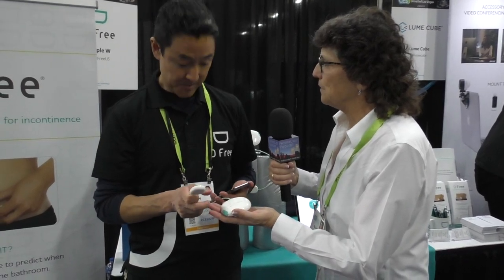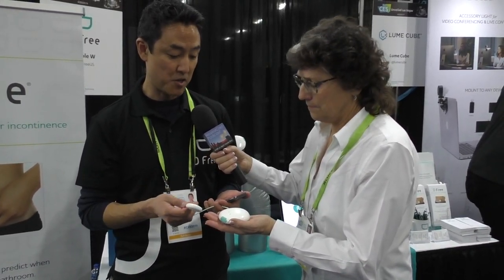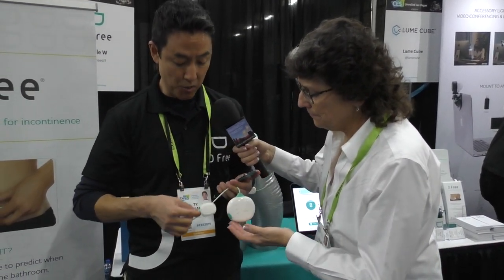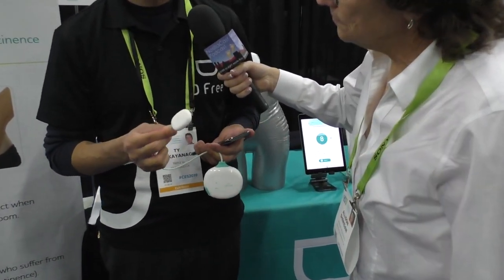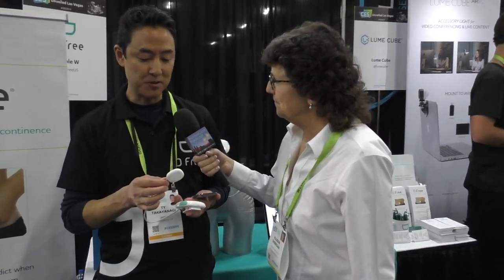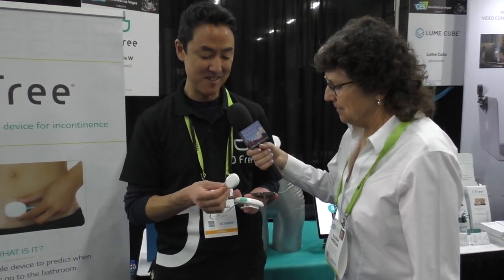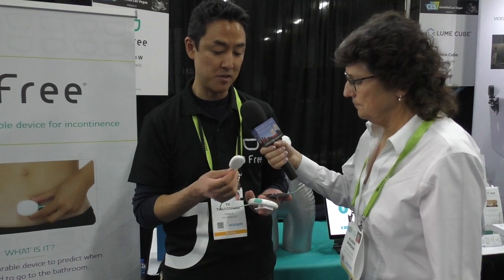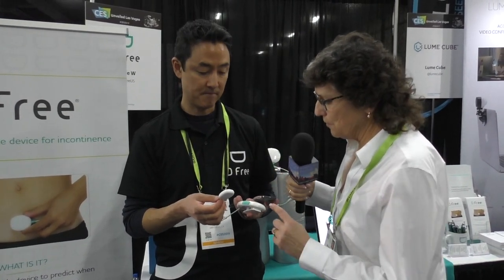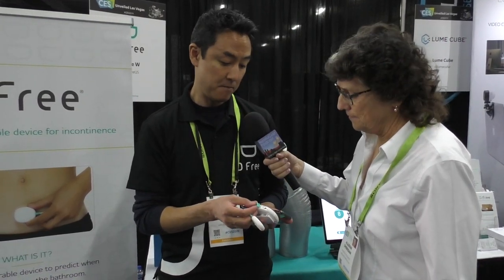The bigger one is the data transmitter. It's got a clip on the back — you put it on your belt or waistband, attach it to your clothing. It's very lightweight so once it's worn on your body you kind of forget about it. The sensor goes on your lower abdomen and is secured using medical tape — any off-the-shelf medical tape will do. You wear it in the morning and the battery is good for 24 hours, so no recharging during the day. It charges via USB.